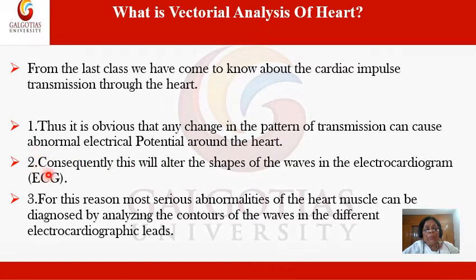Consequently, this will alter the shape of the waves in the electrocardiogram or ECG. For this reason, most serious abnormalities of the heart muscles can be diagnosed by analyzing the contours of the waves in different electrocardiographic leads.